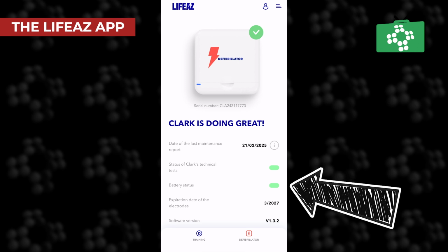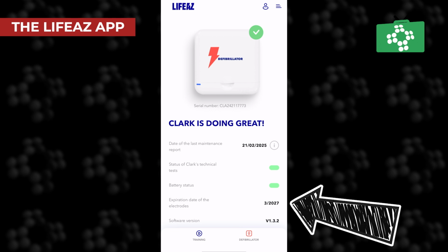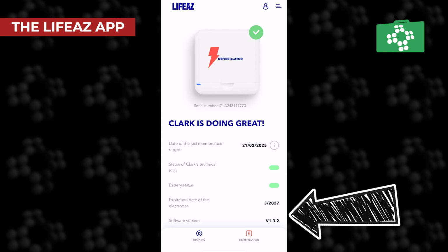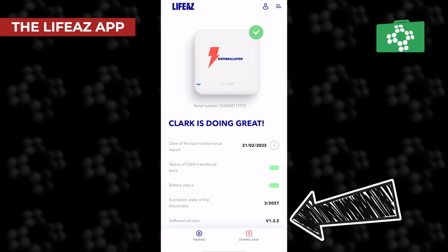It also then states the expiration date of the electrode. So this is March 2027. So it does give you plenty of time and warning as you look at the app to know when the pads need to be replaced. And the final bit there is the software version. So you can see that this is version 1.3.2. And then if we need to do any updates, you'll see that figure change.